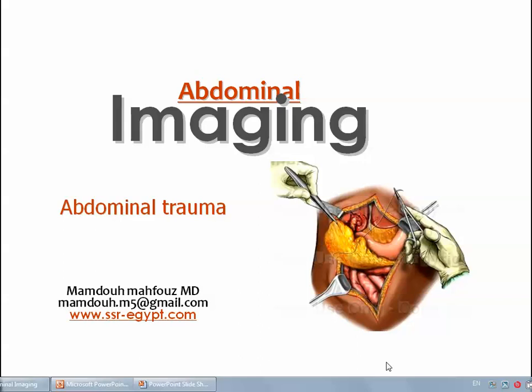Dear colleagues, this is the second lecture in the series of abdominal imaging, and it will deal with the imaging of abdominal trauma.